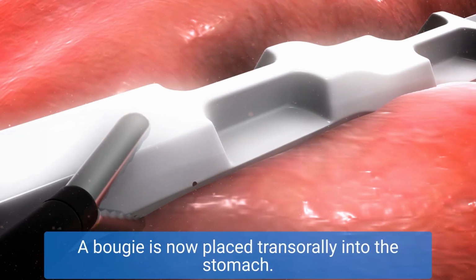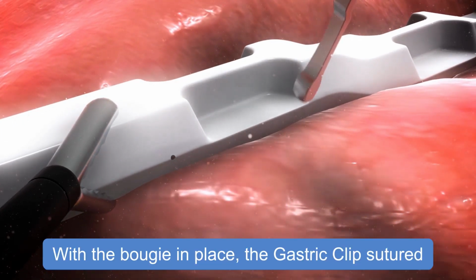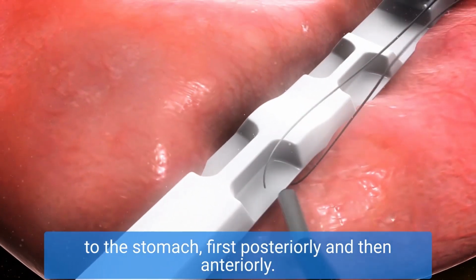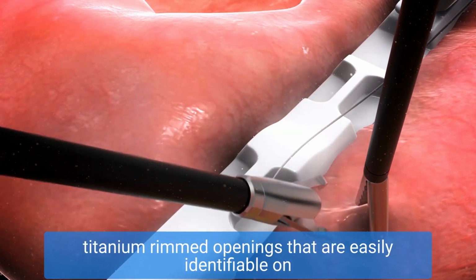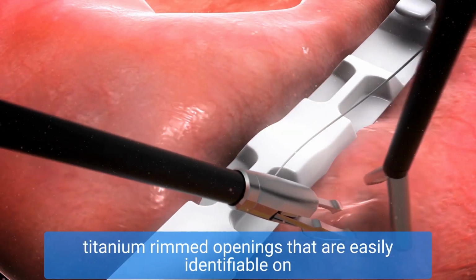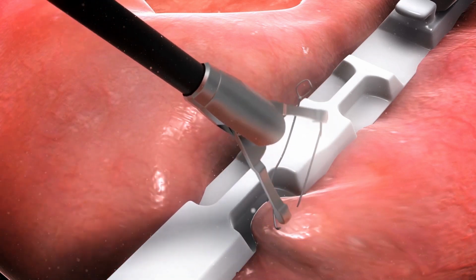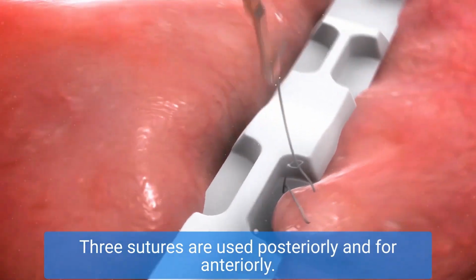A bougie is now placed transorally into the stomach. With the bougie in place, the clamp is sutured to the stomach, first posteriorly and then anteriorly. This is accomplished by passing a suture through titanium-rimmed openings that are easily identifiable on the clamp and then suturing the stomach. 3 sutures are used posteriorly and 4 anteriorly.